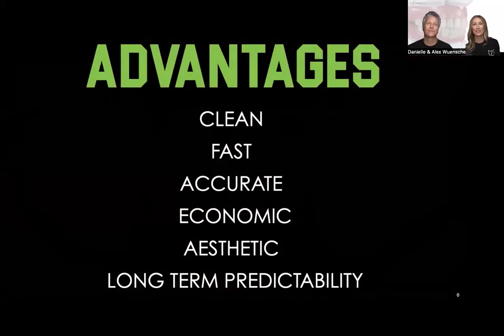So let's talk about the advantages. The first one I would say is that it's very hygienic. So the patient can take it out and clean it. And like Alex mentioned earlier, we would like to see the patient wearing it 24/7. And they can, because it's easy for them to take it in and out. It's relatively fast for us to fabricate the restoration.